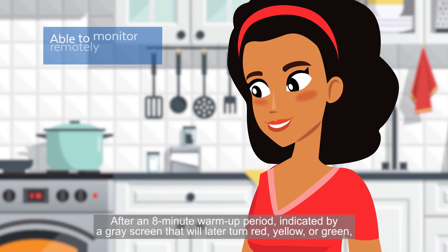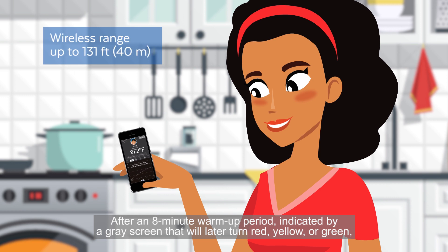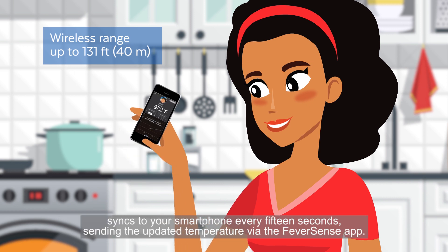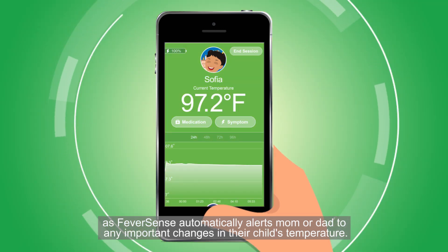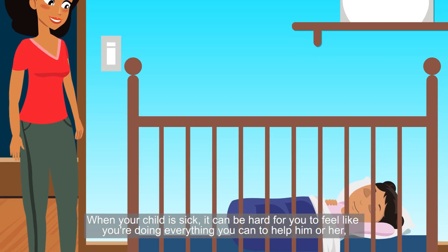After an 8-minute warm-up period, indicated by a gray screen that will later turn red, yellow, or green depending on the child's armpit temperature, the Bluetooth base unit automatically syncs to your smartphone every 15 seconds, sending the updated temperature via the FeverSense app. With this simple system, designed to minimize interruptions and deliver a constant stream of information that concerned parents can depend on.